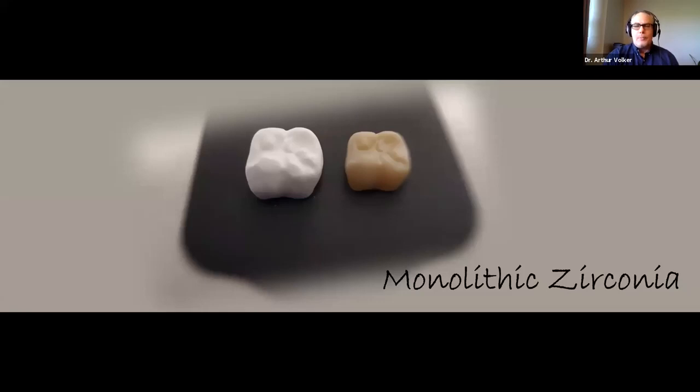The next step would be to stain and glaze it just to enhance the aesthetic appearance if desired. But just know that if your zirconia ever breaks for some reason, or you have a chip in your monolithic zirconia, or quite frankly, this is where it happens more, because these guys typically will not break. But if you try in a crown, and this happened to no one else, I know it only happens to me, you try in a crown, adjust it, it's too tight, adjust the contact, try in the crown, adjust the contact, and then it's like, oh, it's pretty good. And then you go to polish it so it's smooth, and then you put the crown back in, and the floss just smacks the gum with no contact.